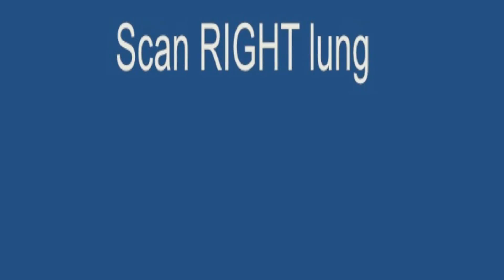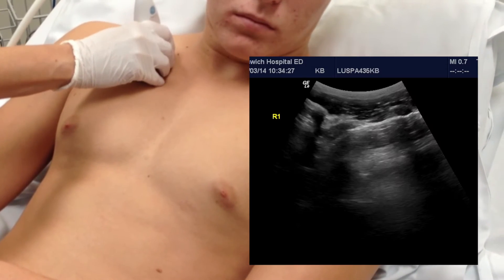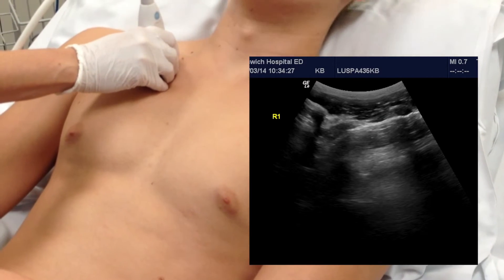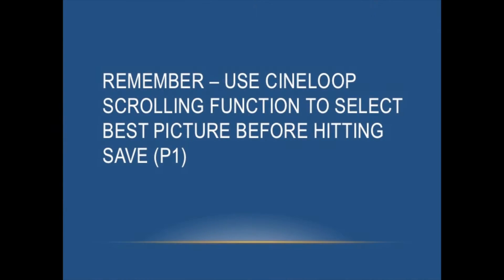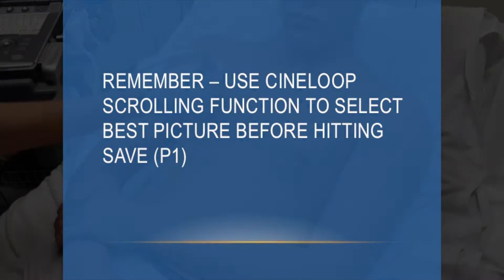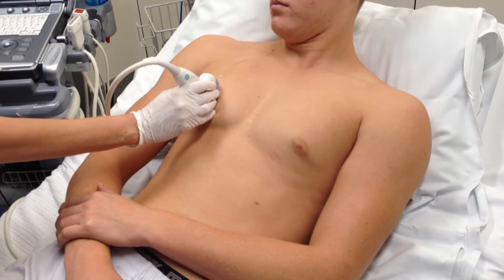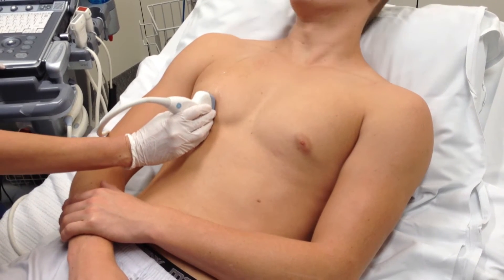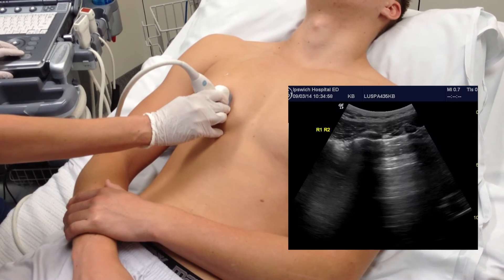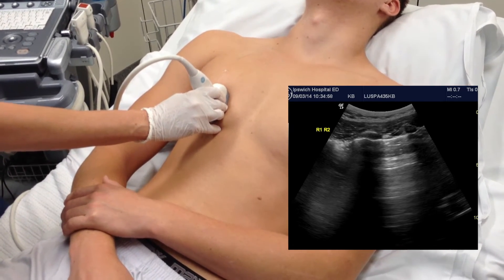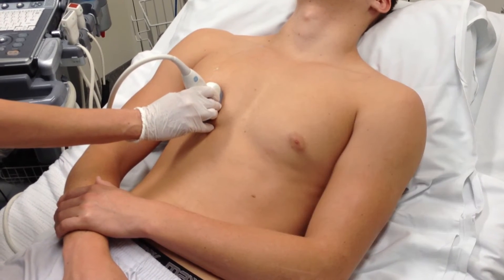We scan two anterior and two lateral regions on the chest. Region 1 is in the midclavicular line, high on the clavicle, such that the clavicle is in the far left of the picture and the second or third rib on the right. Region 2 continues in the midclavicular line, low on the chest just above the diaphragm, aiming for the middle lobe. In older patients this may be at the level of the nipple or above — try to get more lung than liver. Note how the cartilaginous rib allows visualisation of the pleural line beneath the ribs.